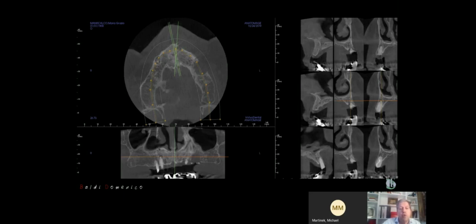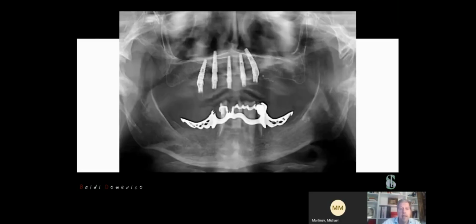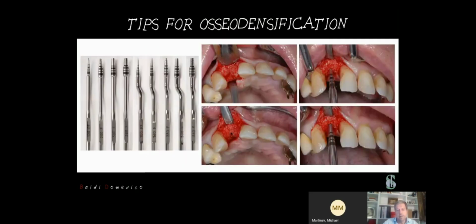And so we have to use the magnetic mallet in order to make the extraction and then to place an implant. Here we plan our surgery before the extraction. And here is how we finish our surgery. And here you can see the healing of the soft tissue and the final work.